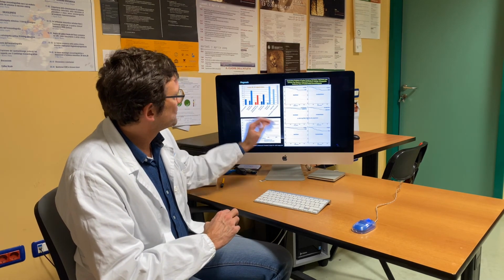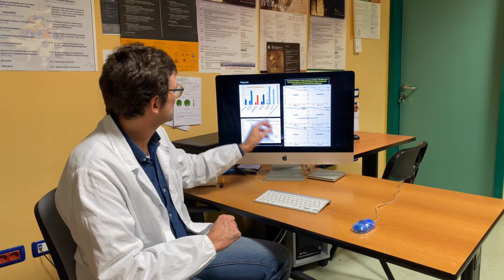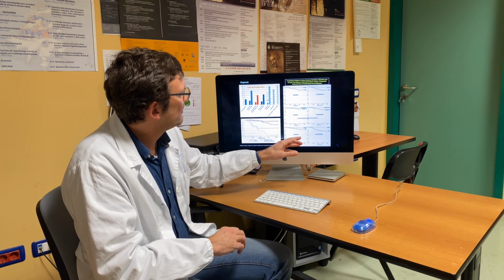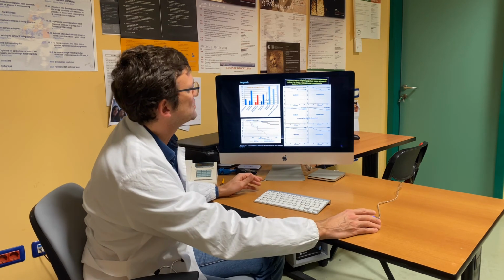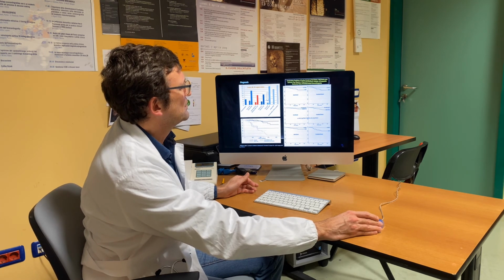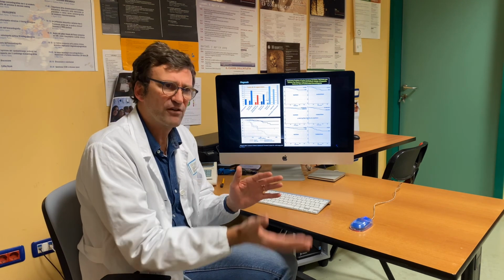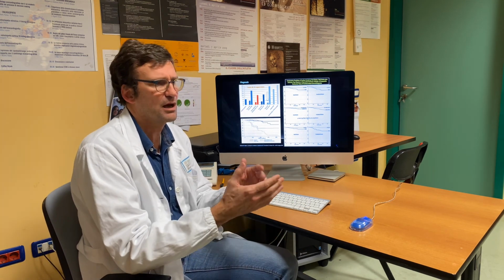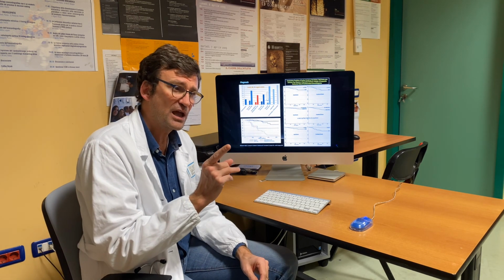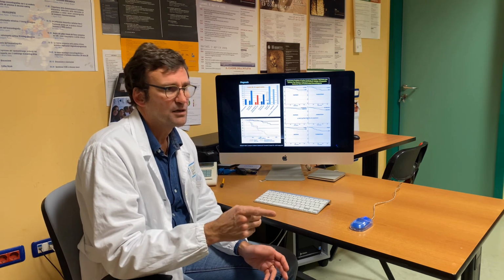And just to conclude, this is a study where we also assessed the CFR. This was together with Tom Marwick, and you have an almost perfect stratification when you also use CFR. So wall motion, CFR, and perfusion can produce this type of level of prognostic outcome that helps a lot in treating coronary artery disease. Even more today, that we know that medical therapy is basic, is key to treat those patients.